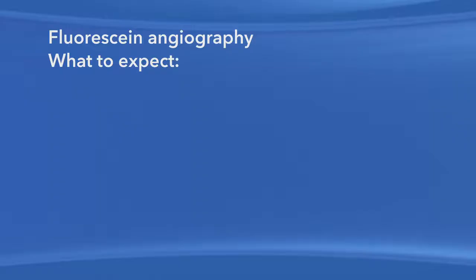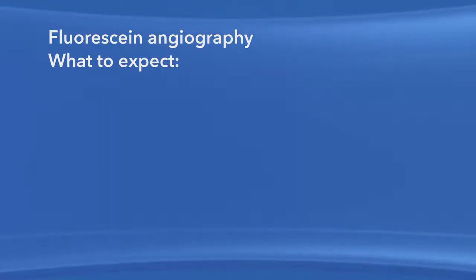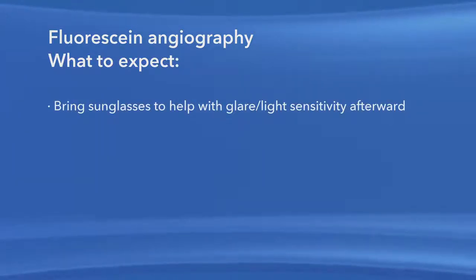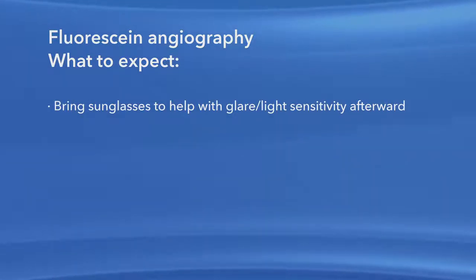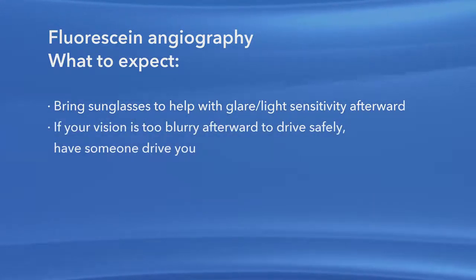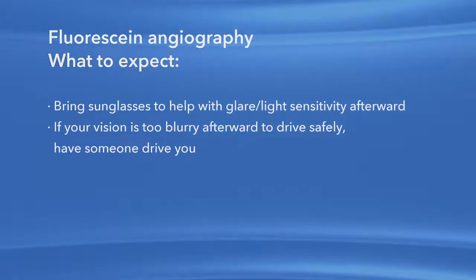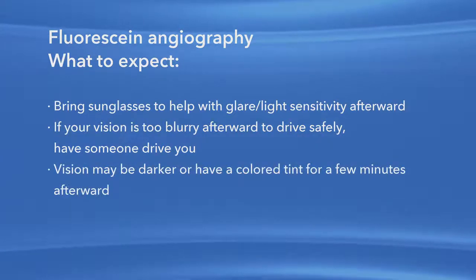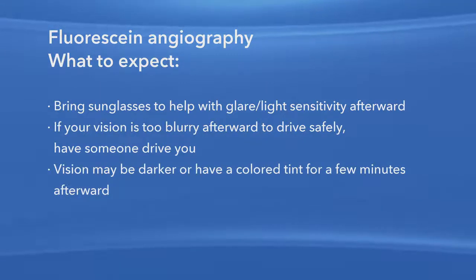If the dye leaks from your vein, a burning sensation may occur on the skin at that site. Because your pupils have been dilated, your eyes may be sensitive to light. Bring sunglasses with you to your appointment to help with glare and light sensitivity when you leave the office. Also, your vision will probably be blurry after dilation, so it's a good idea to have someone drive you home afterwards. Your vision may appear darker or have a colored tint after the procedure. This will last only a few minutes.